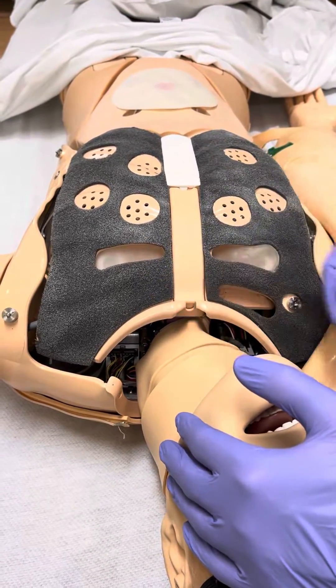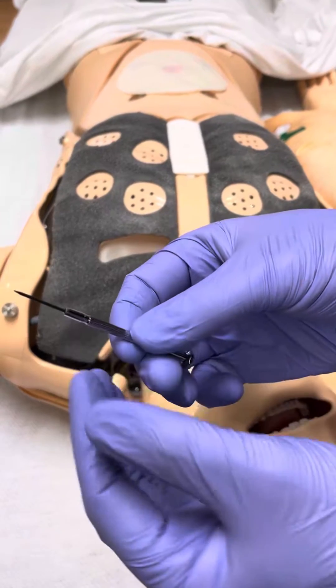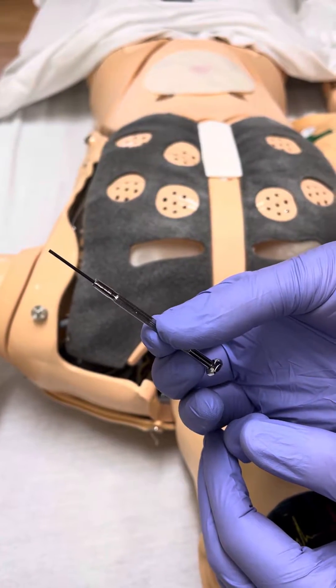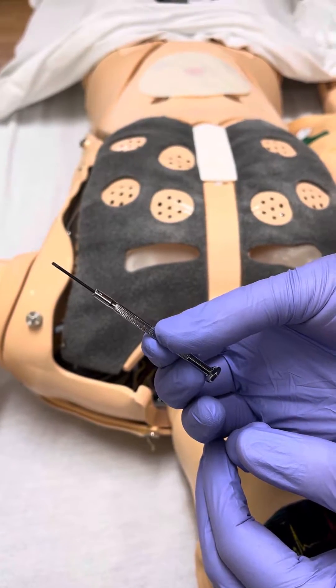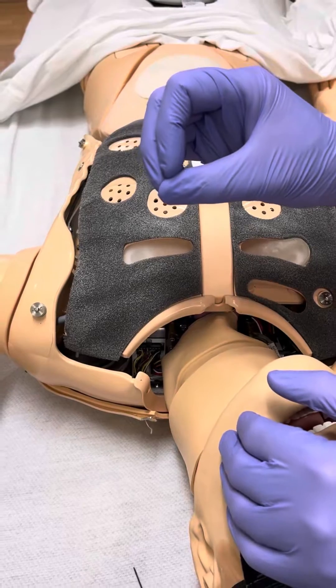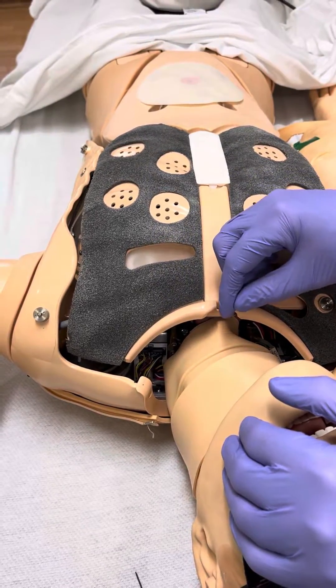If that doesn't work, the next thing we're going to do is take a very small tip screwdriver — one you'd probably use for eyeglasses repairs — and we're going to tighten the connections on the wire loom for the chest plate.